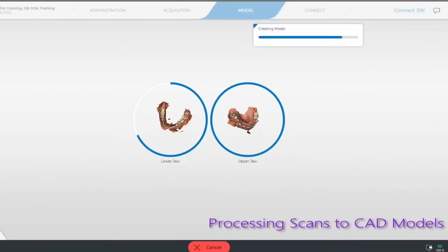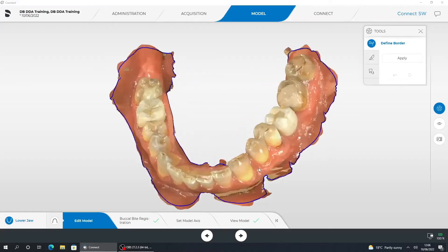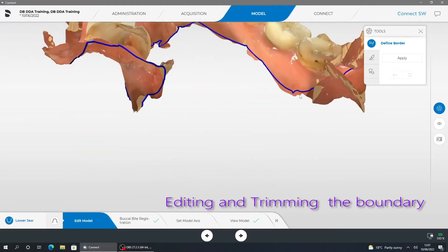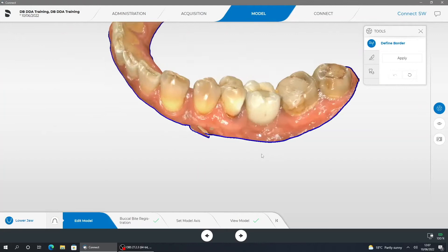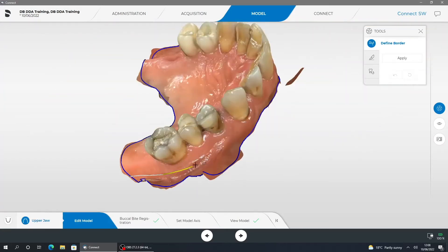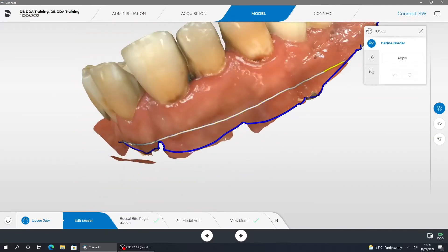The computer will then run an algorithm to produce our STL CAD models directly from the scans taken of our patient. One of the important steps to consider is the edit model phase. Once we have the CAD model created, we edit the model and trim off all the excess scan material we do not wish to produce in the 3D model, leveling it off to get a nice extrusion for a good closed STL that can then be printed.